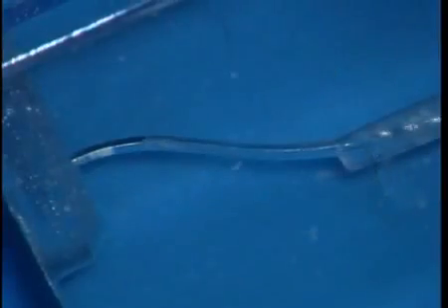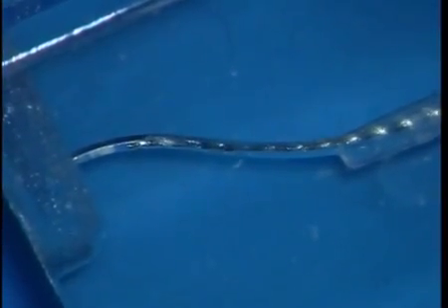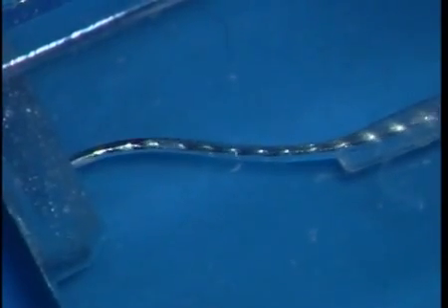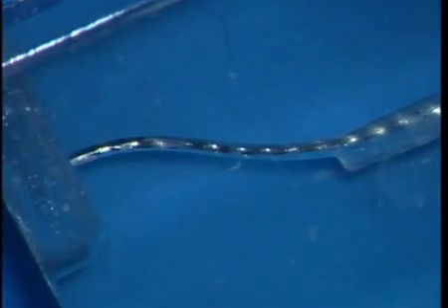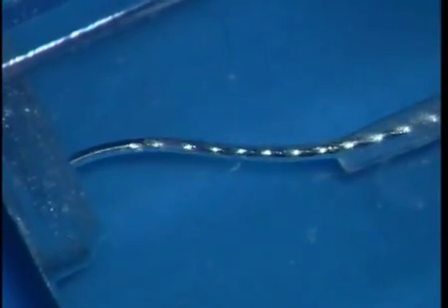The next sequential instrument is the 15 file. The instrument is pre-curved as usual, the handle reciprocated to walk the pre-curved instrument past the ledge. The instrument is worked continuously in an apical direction until we achieve length.